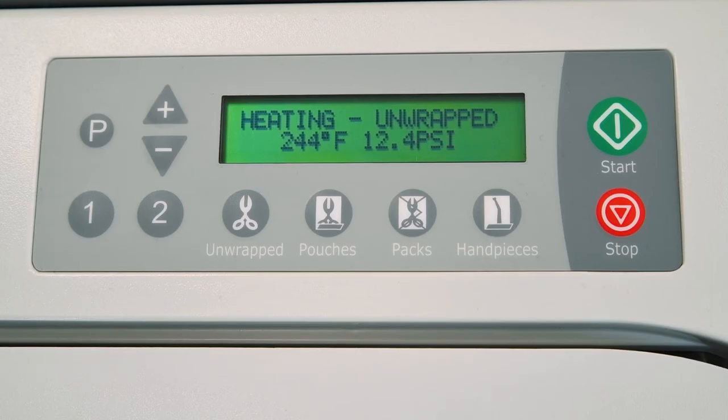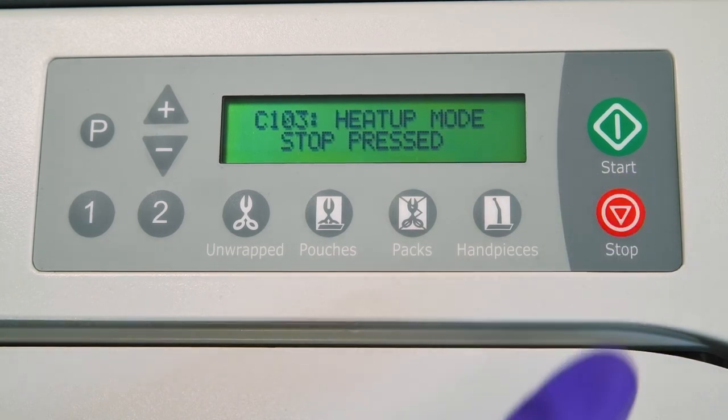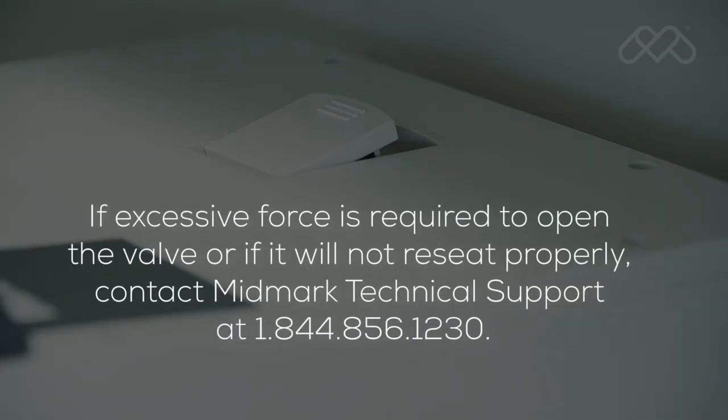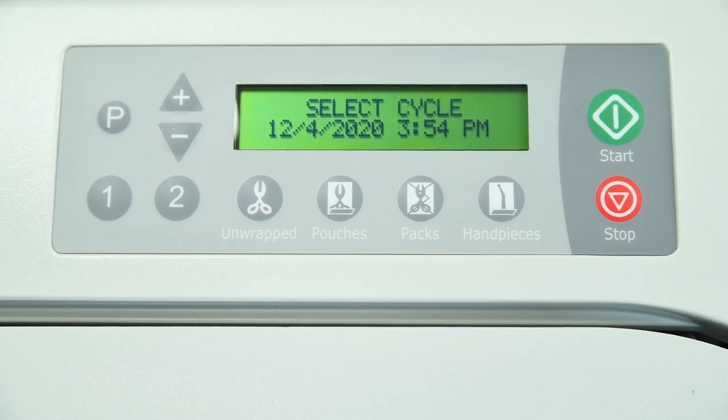Press stop to cancel the cycle, preventing the unit from overheating, and allow the chamber to cool. If excessive force is required to open the valve, or if it will not reseat properly, contact Midmark Technical Support at 1-844-856-1230.